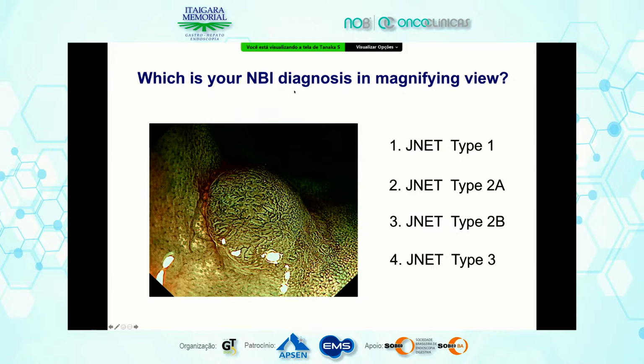Show me the result. Great. Correct answer is type 2B. There is an irregular pit-like structure.